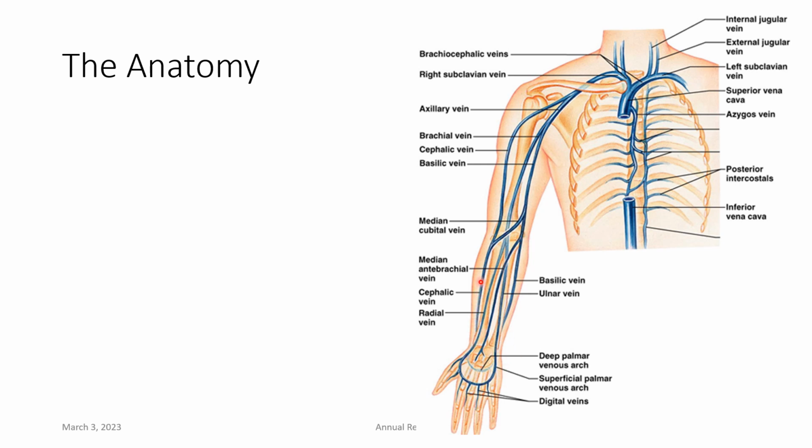Now all three of those are going to come up to this antecubital region, and they are going to communicate via the median cubital vein. Now that doesn't mean that's the end of these veins, it just means that's where they're communicating. Now on our ulnar side, we had that ulnar vein go up, it connected with the radial vein, and they produced the deep vein known as the brachial vein.